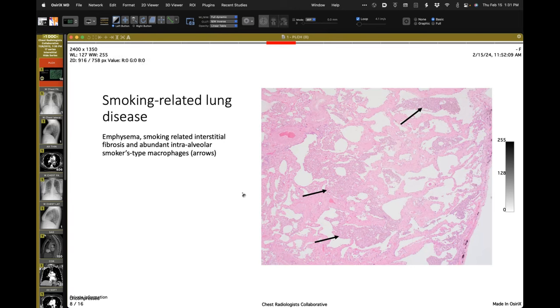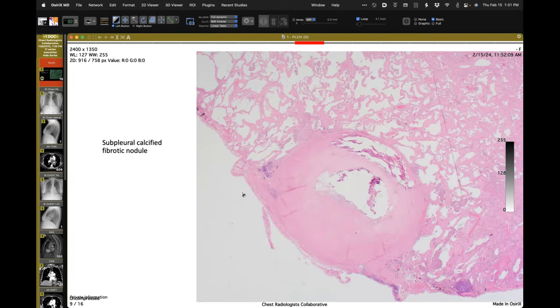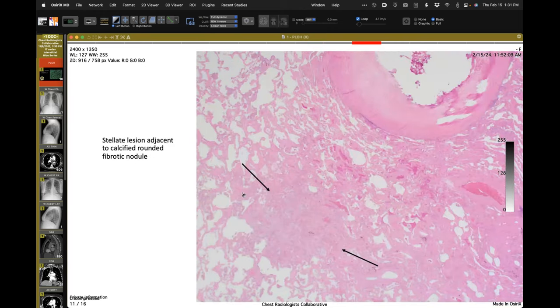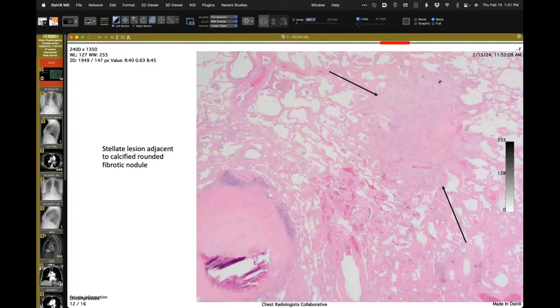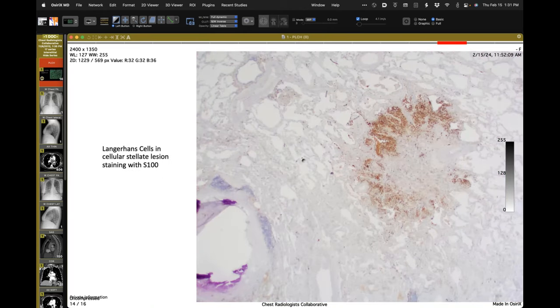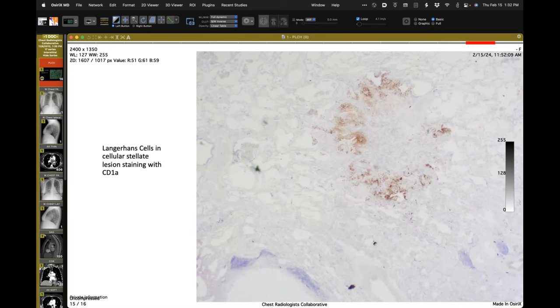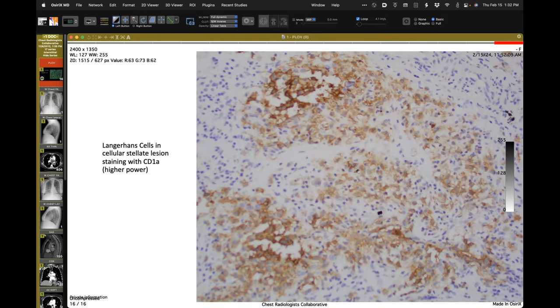Some of the interalveolar septa show pink staining — very pink staining — consistent with SRIF, expanding those interlobular septae. Some granulomas. There's a nice stellate, very cellular lesion. S100 staining the Langerhans cells in a stellate lesion. CD1A staining those cells again. Really nice imaging-pathology correlation: PLCH.